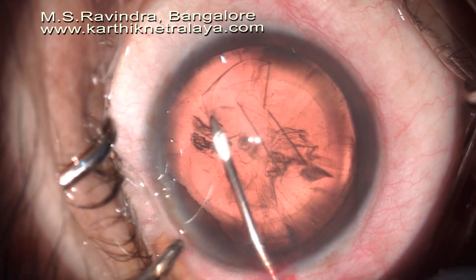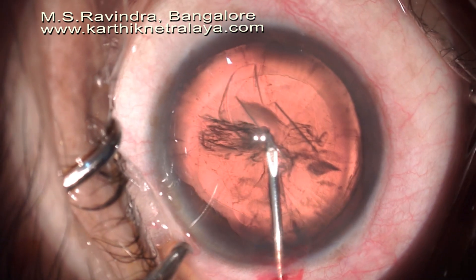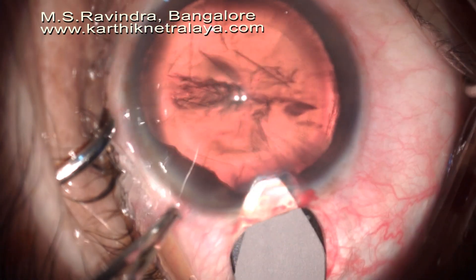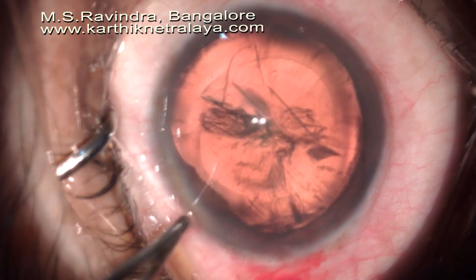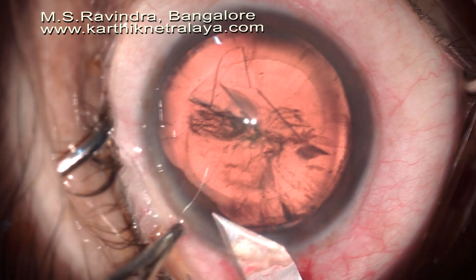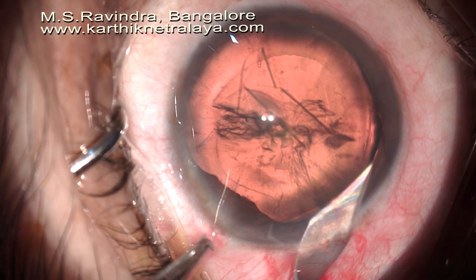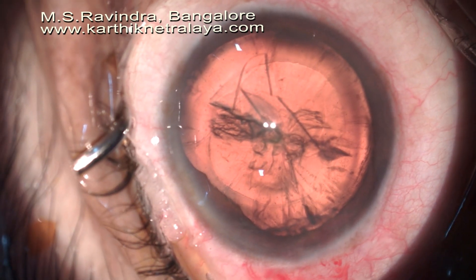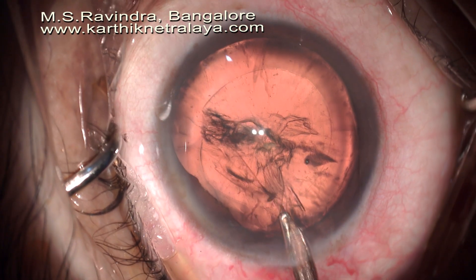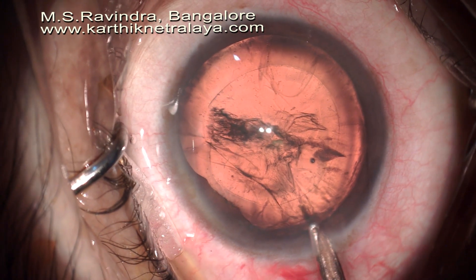I noted that I could not complete the rhexis — it was rather pulling the zonules rather than tearing the capsule. I stopped at the very end of the rhexis creation, then enlarged the internal lip of the tunnel to create a trapezoid tunnel. This is a sclero-limbal corneal tunnel. Very importantly, if you have not completed the rhexis, you must complete it very carefully using either an Utrata forceps or a Simcoe cannula. You can see the completion of the rhexis — otherwise you risk an inadvertent pull on the entire capsular bag.